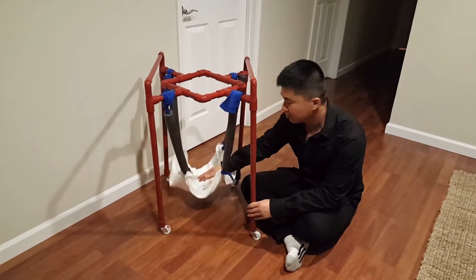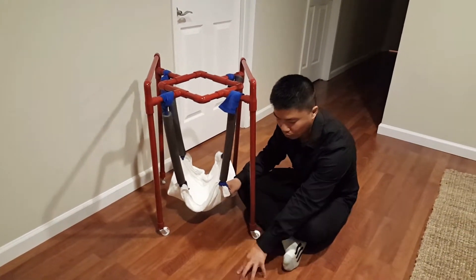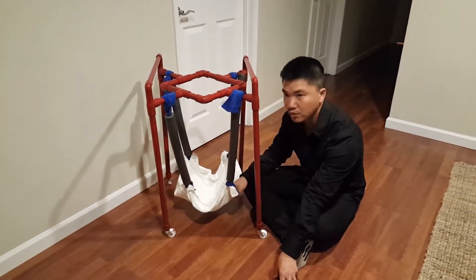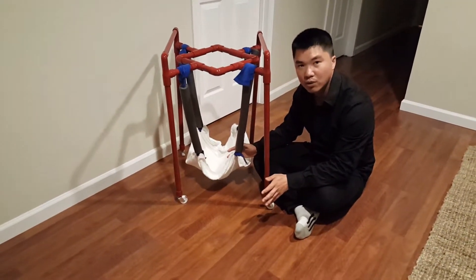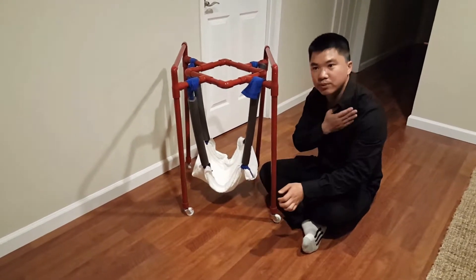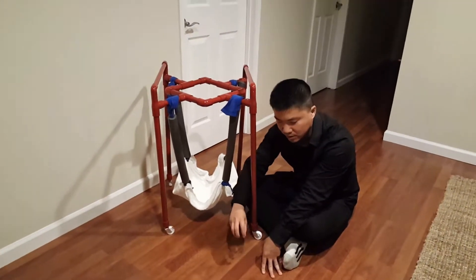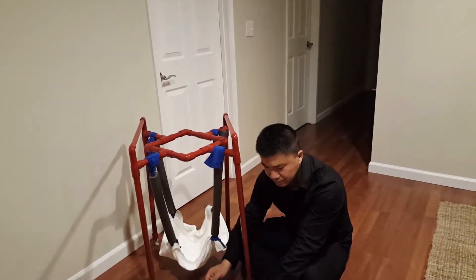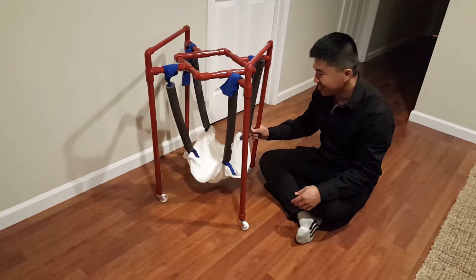Another thing this is good for is fine motor training. When the baby is in the holder — the support area — you could put a toy in front of it for the baby to reach for, which works on reaching skills. For kids who are a little bit older, if you want to work on fine motor finger dexterity, you could work on upper extremity skills — like put a box in front and have them take things out, or work on handwriting. There are a lot of optional activities for it.